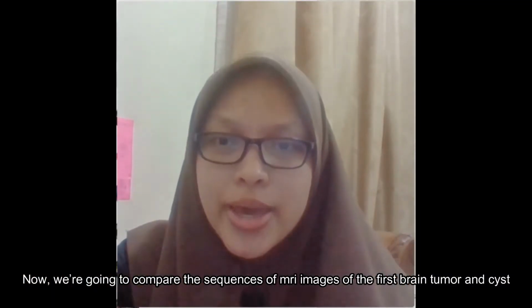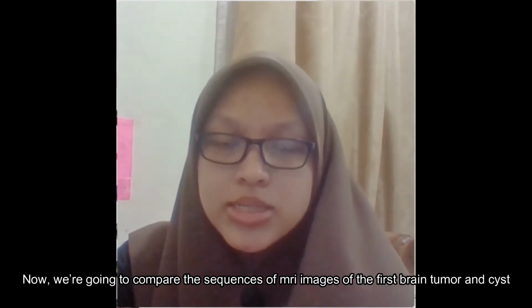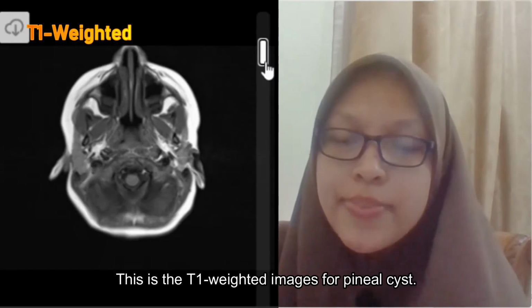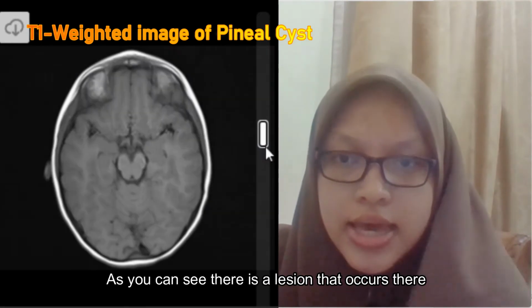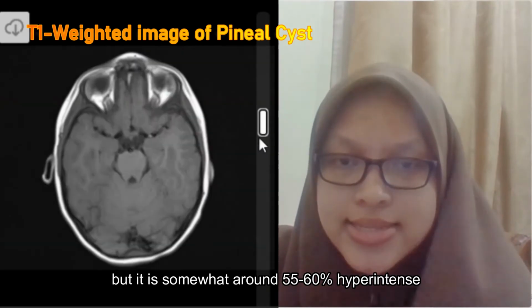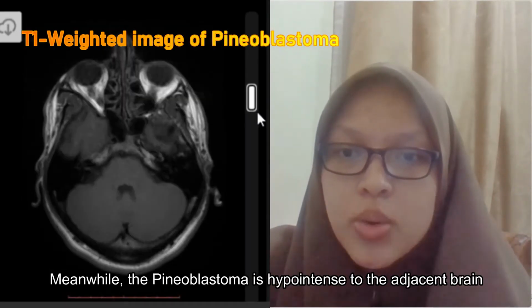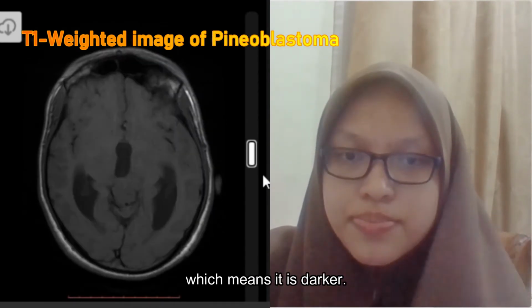Now, we are going to compare the sequences of MRI images of the first brain tumor and cyst, which are the pineoblastoma tumor and pineal cyst. This is the T1 weighted image for pineal cyst. As you can see, there is a lesion there, but it is somewhat around 55 to 60% hyperintense, which means it is brighter when compared to the cerebrospinal fluid. Meanwhile, the pineoblastoma is hypointense to the adjacent brain, which means it is darker.